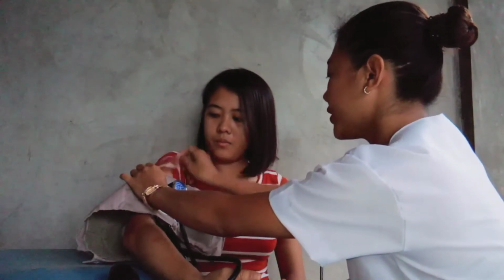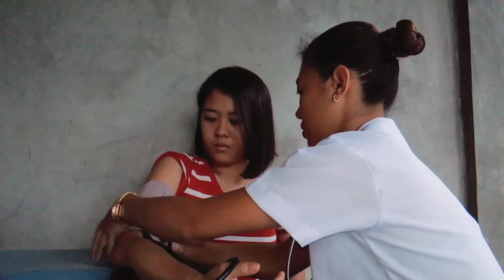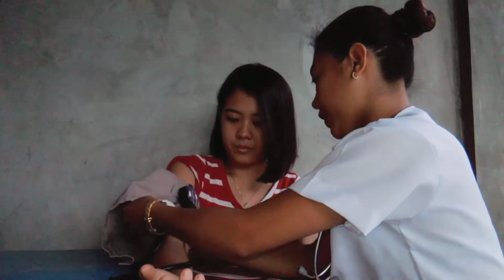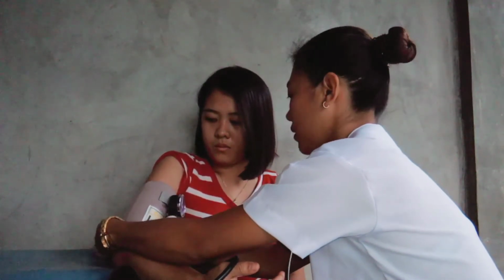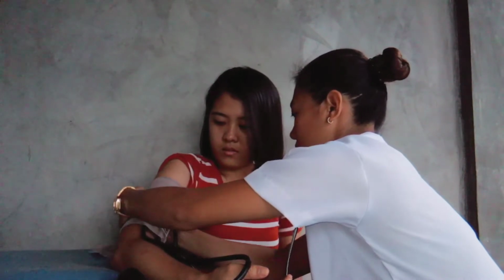Put the cuff 2 inches above the bend of her arm.